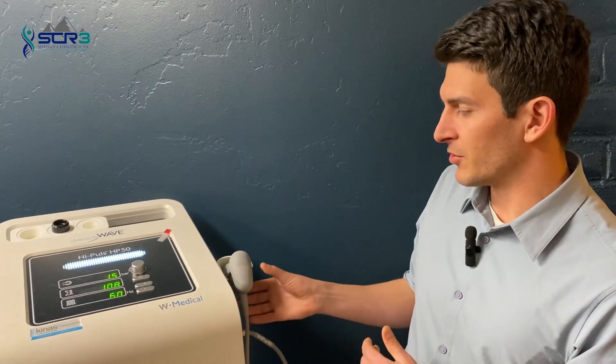What might a shockwave treatment look like? The typical way a shockwave treatment goes is first we're going to perform an evaluation of whatever injured area we're dealing with. That way we know this is going to be a really good treatment for you, making sure that our office is the best fit — or if not, we'll recommend some other type of treatment or a different office.